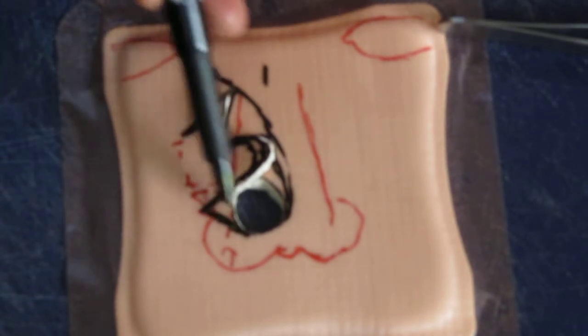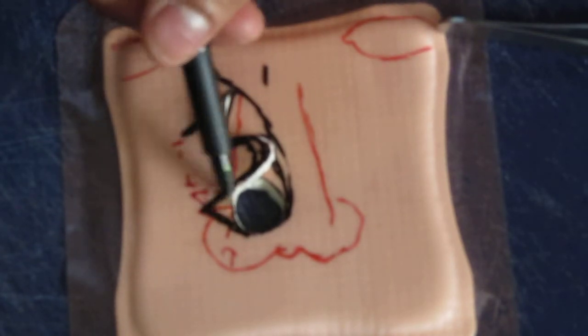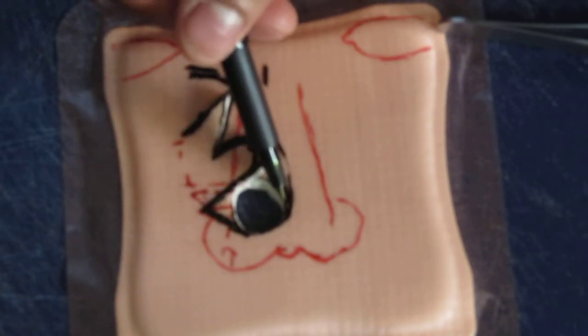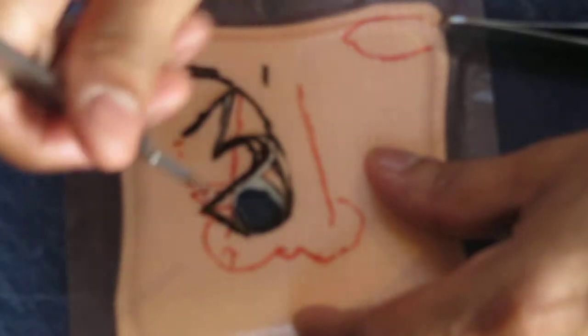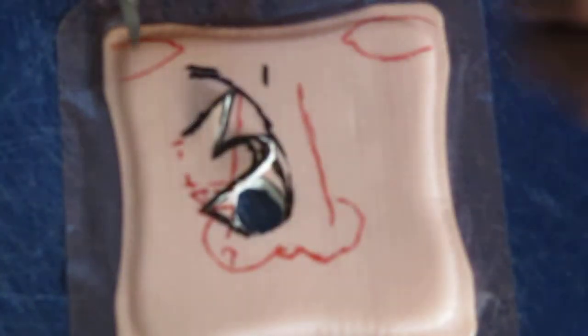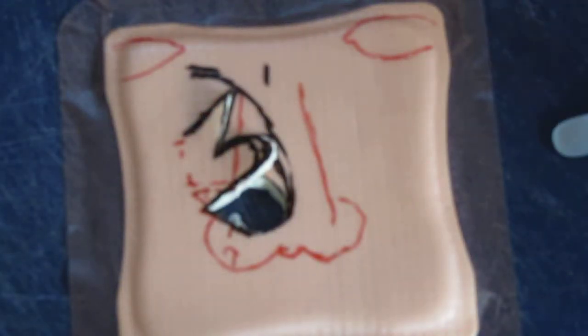So this is a standard sort of 60-degree dog ear, and we've come out about this distance from here to the dog ear is about 1.5 times the diameter of the defect. Okay, so we will take this dog ear out prior to flap movement, although some people advocate that you could just take it out afterwards. I find it easier to take out straight away, simply because it allows you to see the bleeding points on the nose and allows you to cauterize without putting too much tension on the flap.